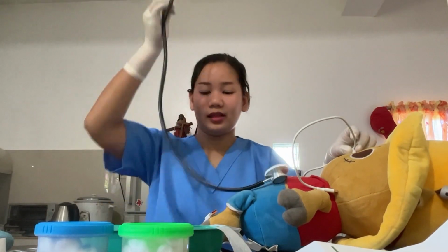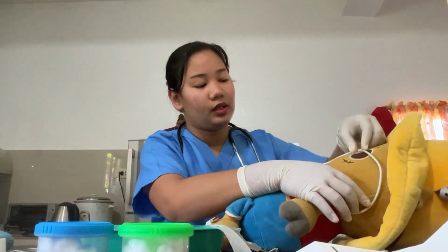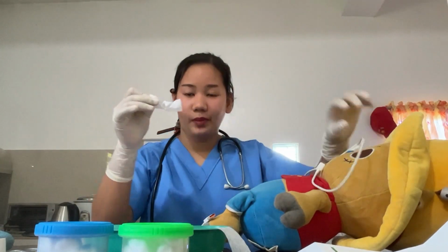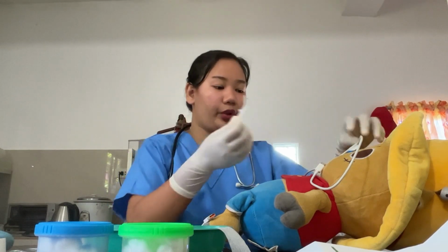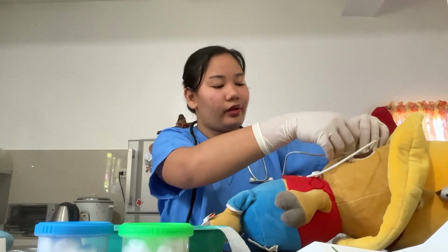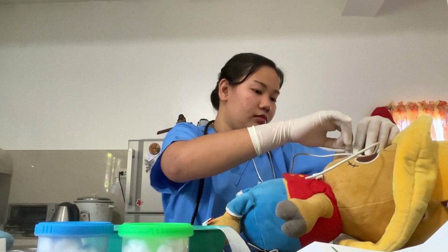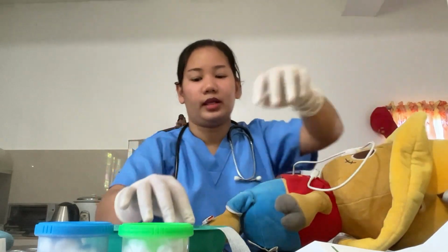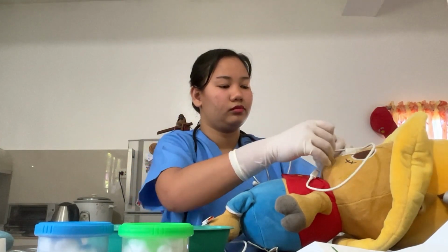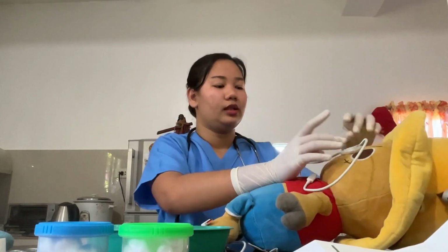The tube is intact. Now I will secure this tube by taping it with a leukoplast tape. So let's assume that this is a leukoplast tape, since I only have a micropore tape. I will now secure this tube. Okay, and another.